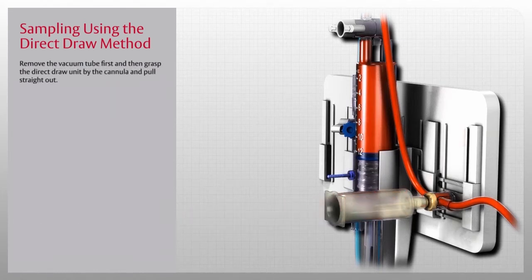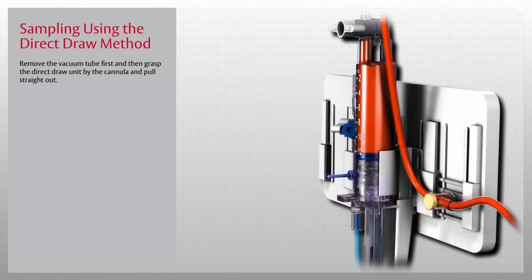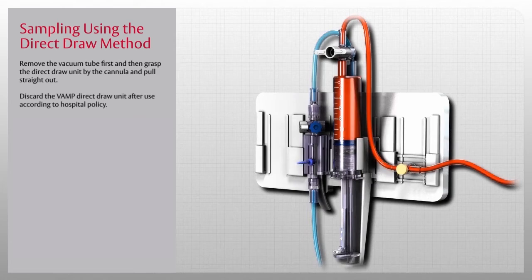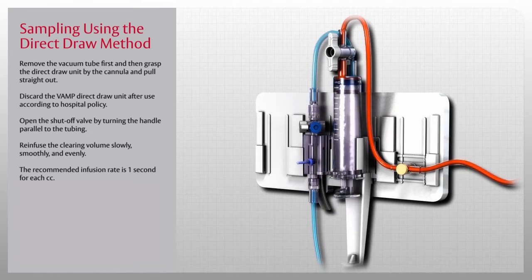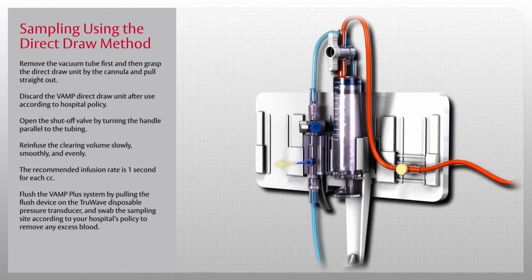When the last sample has been drawn, remove the vacuum tube first, then grasp the direct draw unit by the cannula and pull straight out. Discard the VAMP direct draw unit after use according to hospital policy. Once all samples have been drawn, open the shutoff valve by turning the handle parallel to the tubing and re-infuse the clearing volume slowly, smoothly, and evenly — the recommended infusion rate is one second for each cc. You will hear an audible click when the plunger is in the closed and locked position. Flush the VAMP Plus system using the TruWave disposable pressure transducer and swab the sampling site according to your hospital's policy to remove any excess blood.